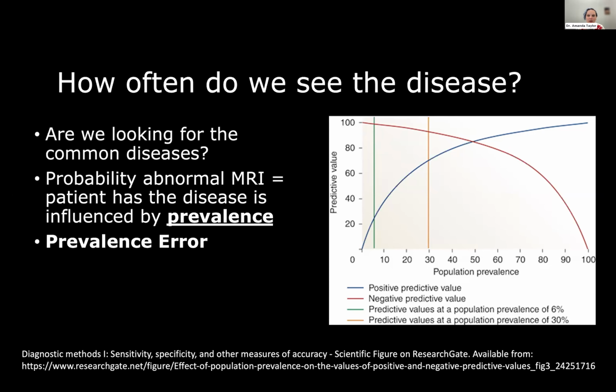Remembering that if they're not very common, you might be less likely to find them. So in a dachshund with T3-L3 myelopathy that's acute and painful, we're highly likely to have an abnormal MRI with an intervertebral disc herniation found.